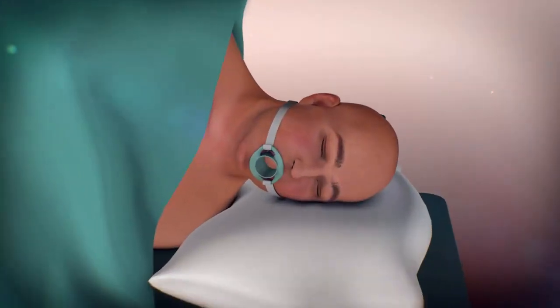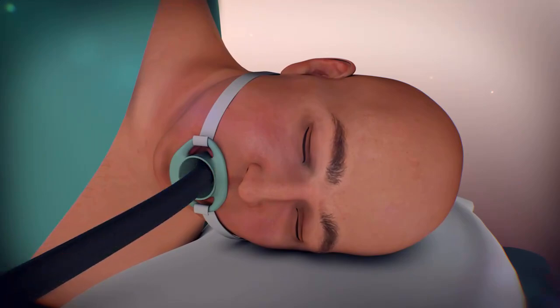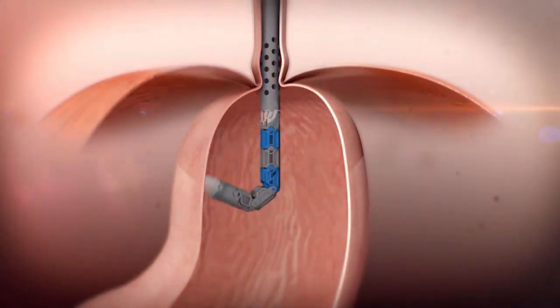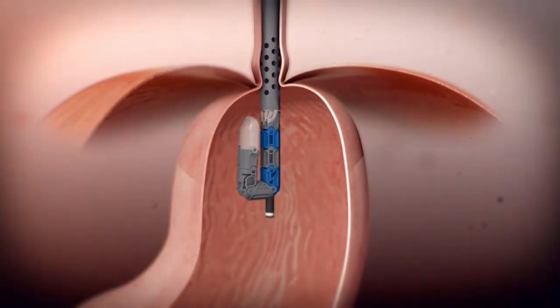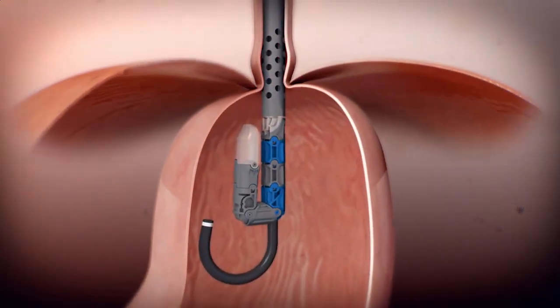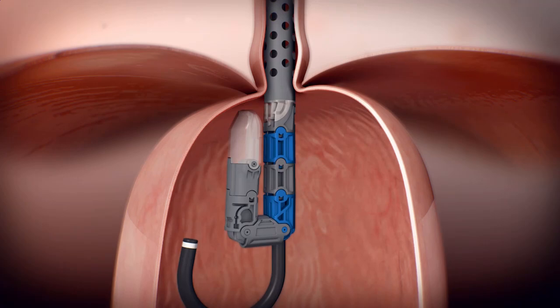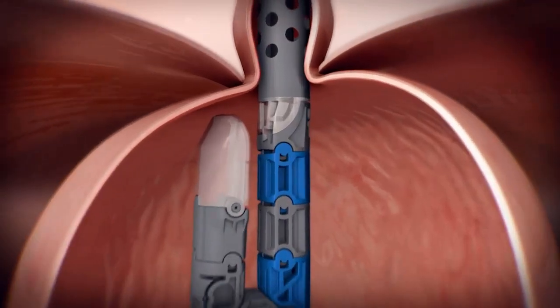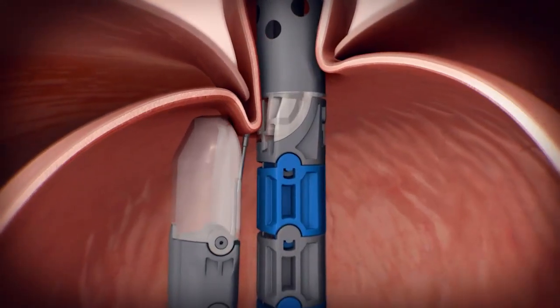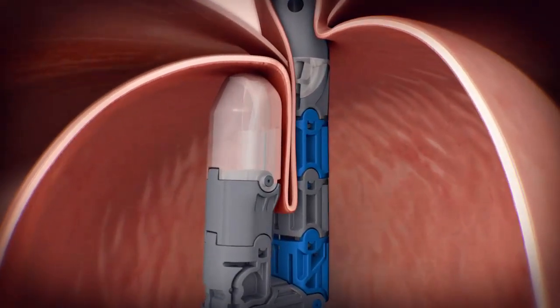While under general anesthesia, the device and endoscope are gently guided through the mouth and esophagus into the stomach. The endoscope is advanced and positioned so that it is viewing the area where the esophagus meets the stomach. The valve reconstruction begins when the physician retracts tissue and pulls it gently into the tissue mold and wraps tissue, building a new valve.